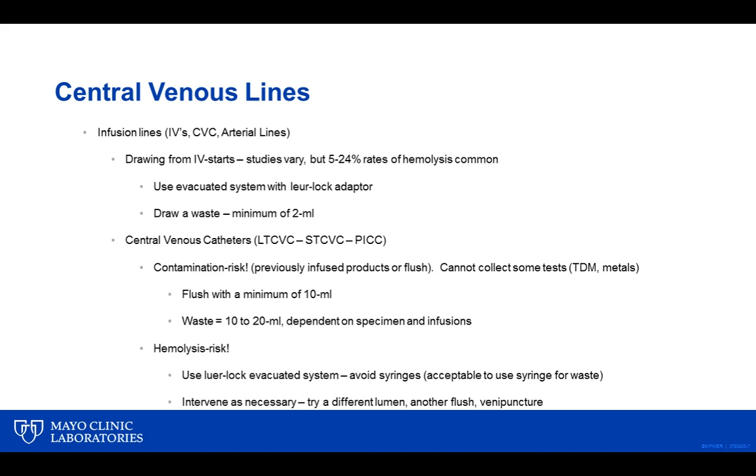We've been successful here reducing that significantly, and the success was the fact that we are now requiring a waste. Upon the start of the IV, the insertion of the IV, before we collect any blood for analysis, we require a minimum of 2 mL of waste to be drawn off that IV start before we actually will accept any blood for a sample.